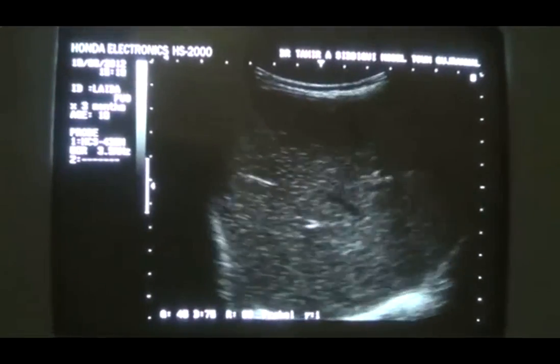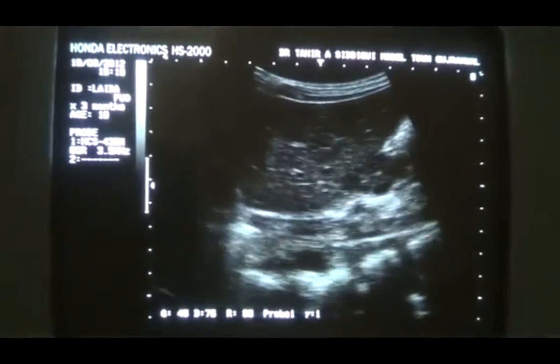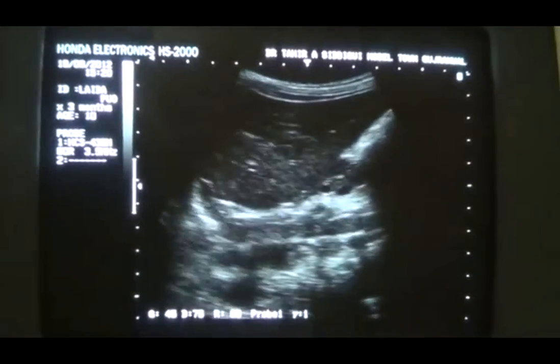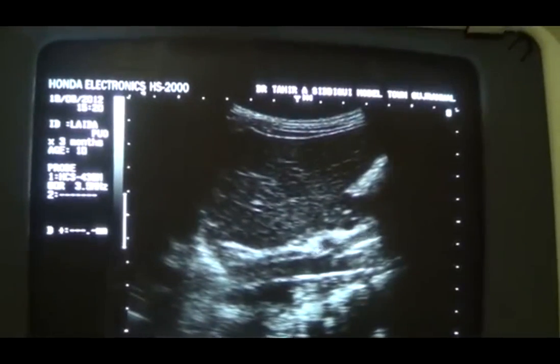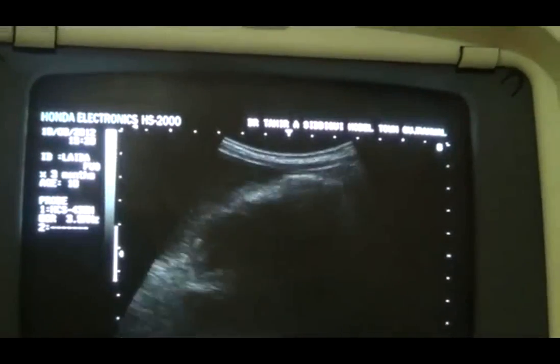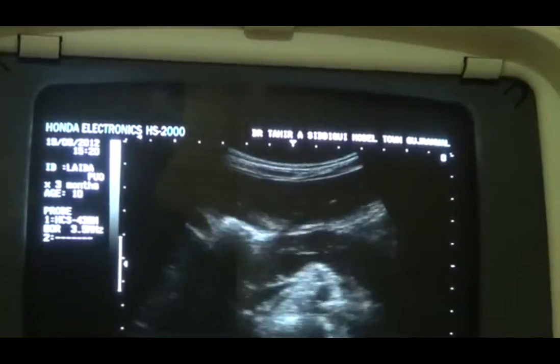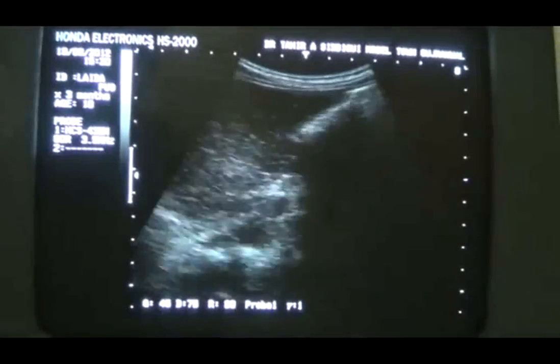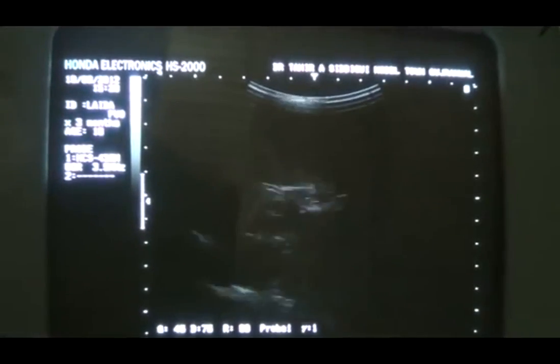The minor portal vein radicals are very prominent, and let's see if there is any lymph node at the para-aortic region as a cause of PUO. This is the superior mesenteric artery, celiac artery, the aorta, and we don't see any lymph node in this region. No lymph nodes, at least in this region, no pleural effusion, and so this area is clear, except the findings that I have just narrated.